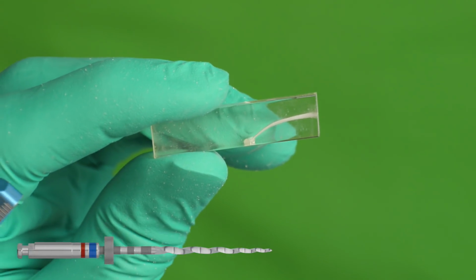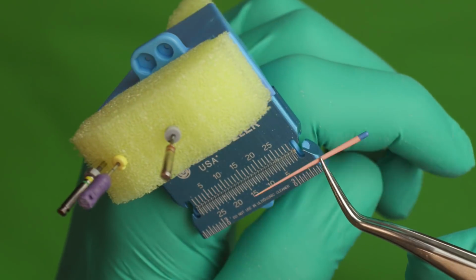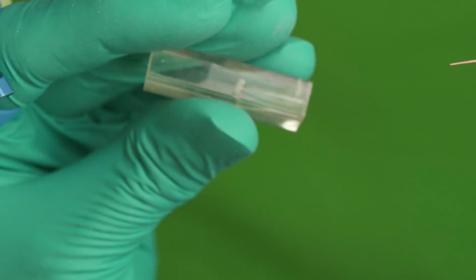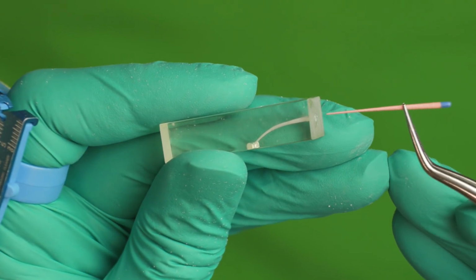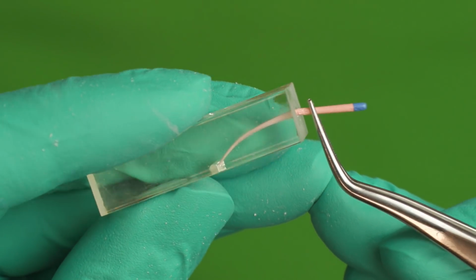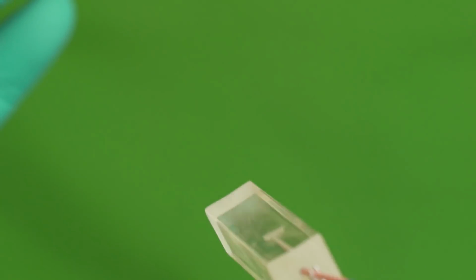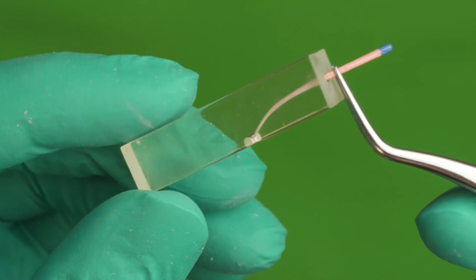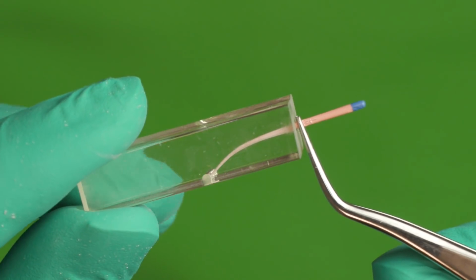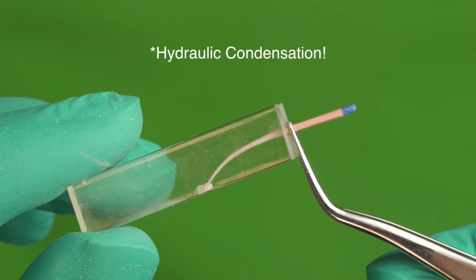And now it's time to fit our cone. So we're going to basically take our cone and measure it to be at 19 millimeters. And there it is. The cone is at 19 millimeters, and now the goal is to seat the cone all the way. And there it is. The cone is seated to the end. And there we go. We have nice tug back. The cone is being held in place, and that looks great. So at this point now we just have to fill in the gap between the cone and the block using a little bit of BC sealer, and that's the technique.